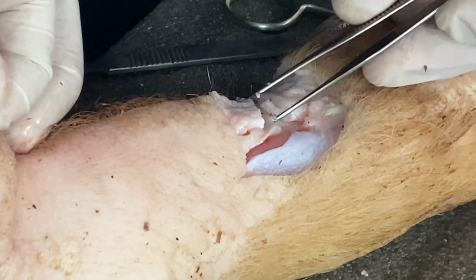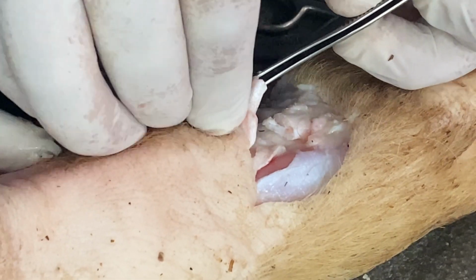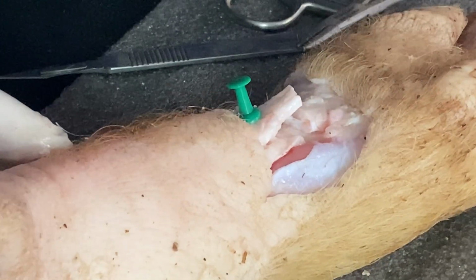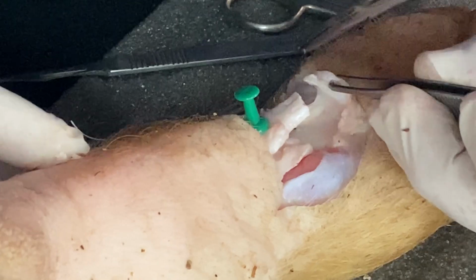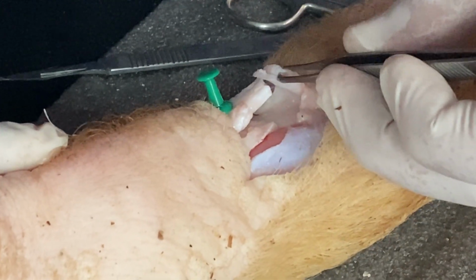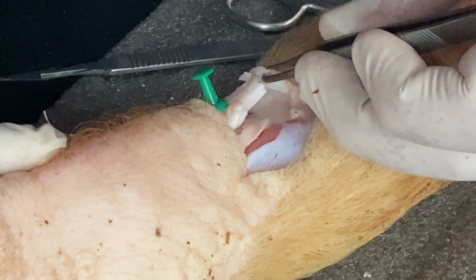Right? We insert a needle in such a way that it should be away from the site of repair. If we insert it nearer to the site of repair, then it will be difficult for us to repair. You know? So the needle should be away from the site of repair. This is not the way we apply a needle in a tendon when we have to repair, but this is just the principle, so that you people can understand.